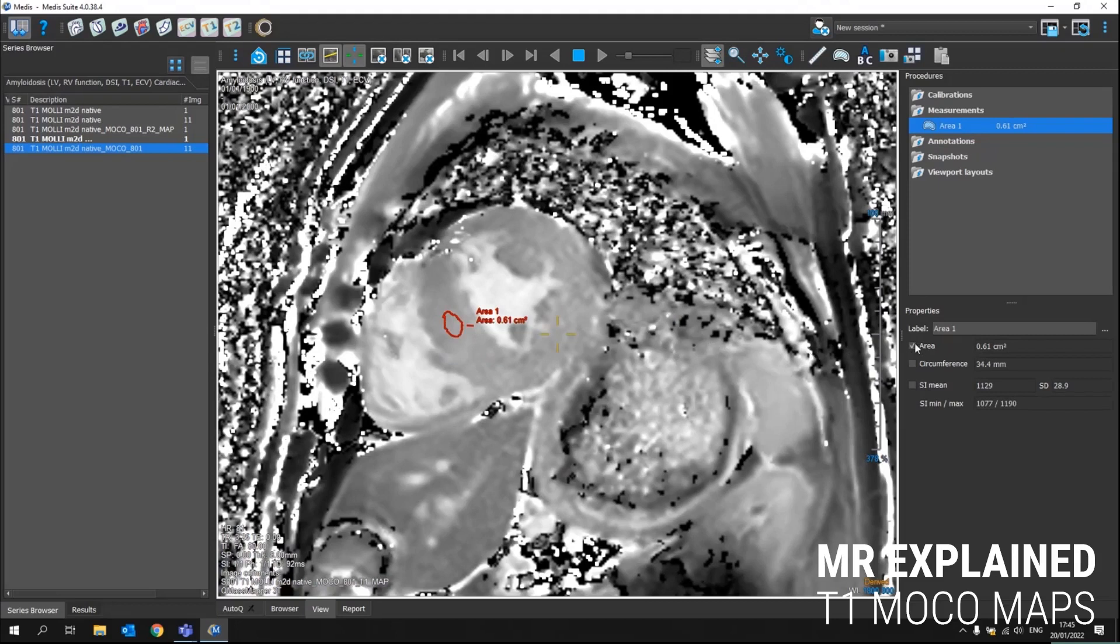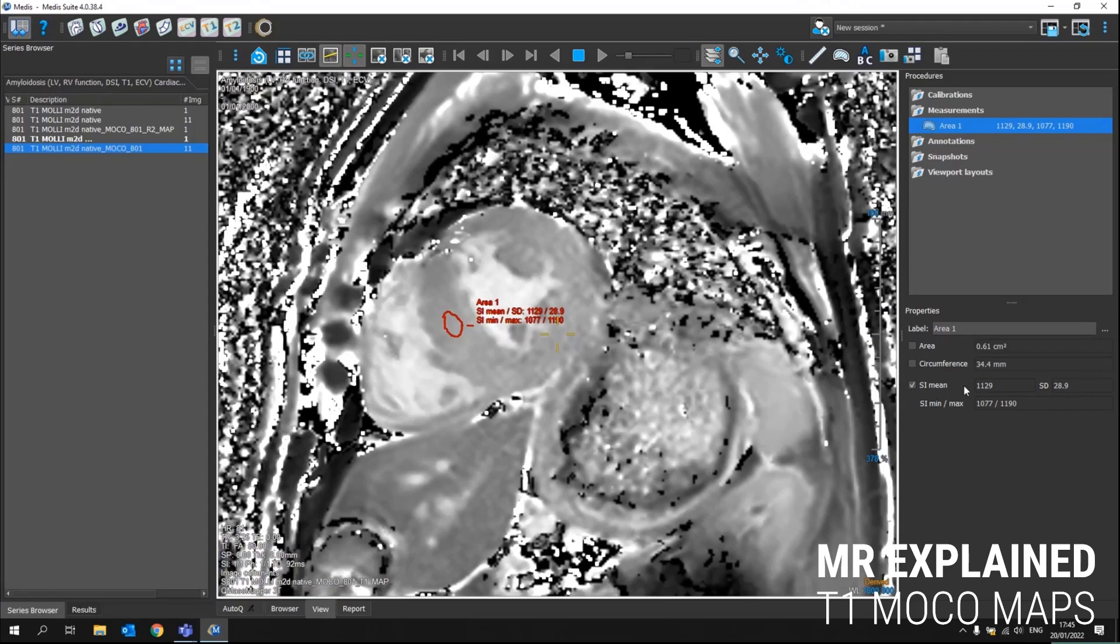By default, it will provide you the area. But in this case, the signal intensity of those pixels will provide you the T1 value. So the average or the mean signal intensity within this area will provide you the average T1 value.